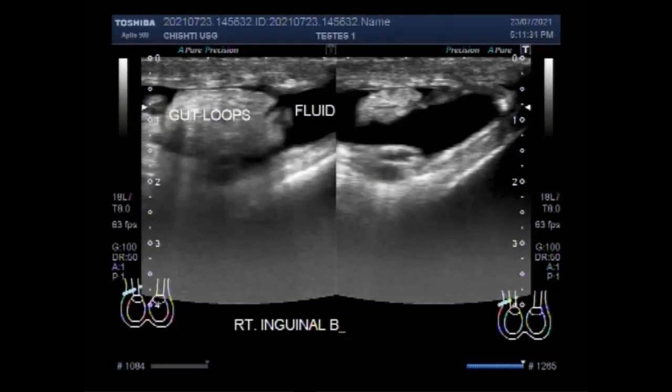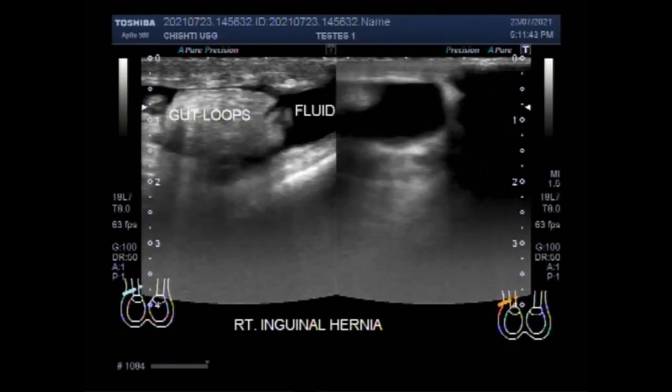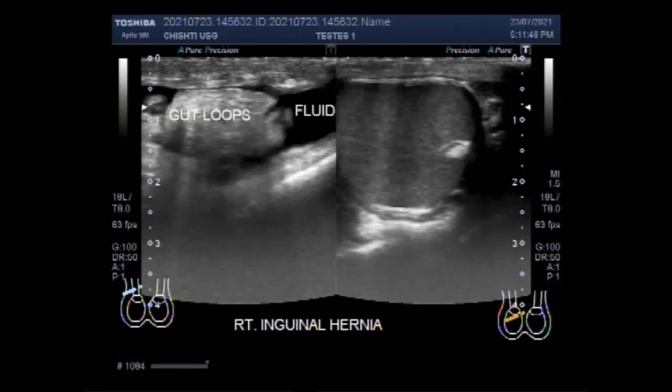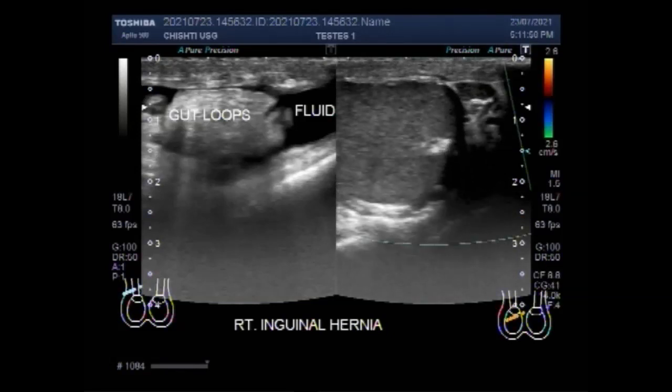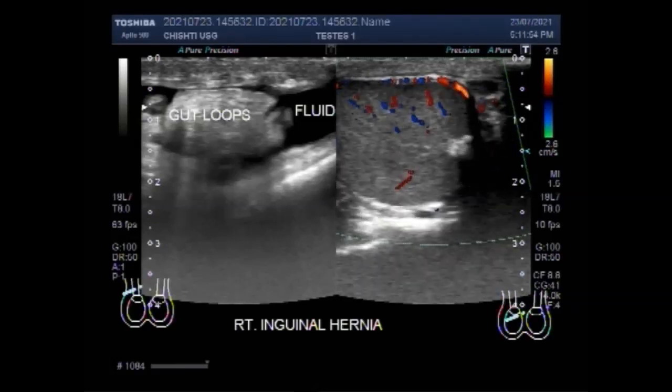Examination of an adult for an inguinal hernia is best performed from the seated position with the patient standing. The inguinal canal areas are visualized for the bulge. A provocative cough may be necessary to expose the hernia. The cough is repeated as the examiner invaginates the scrotum and feels for an impulse.